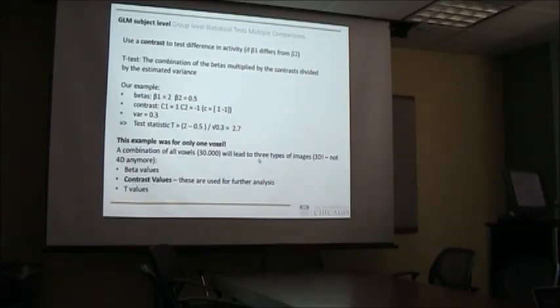This also means that, for example, if you look at the images from your data, these statistical images are a lot smaller than your raw MRI EPI images, just because they contain a lot less data. So there's quite a bit of data reduction that happens in this whole process of model testing.